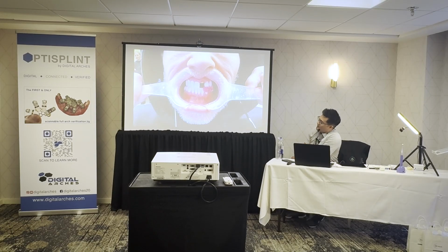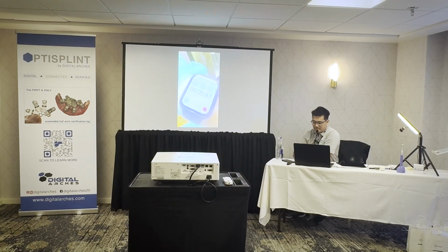And so what he did was, he's a Dawson guy, so he manually put him into central relation, and he captured a bite registration. And so we took a CT scan with that, because my CT scan is what I use to merge everything together. So the bite has to be right on. So he did that.